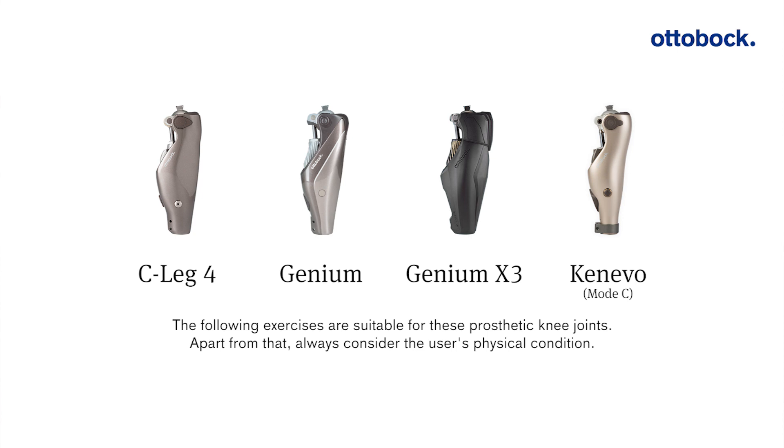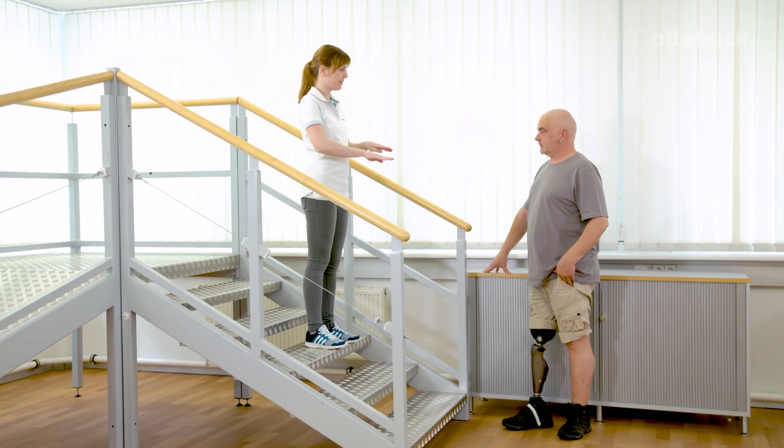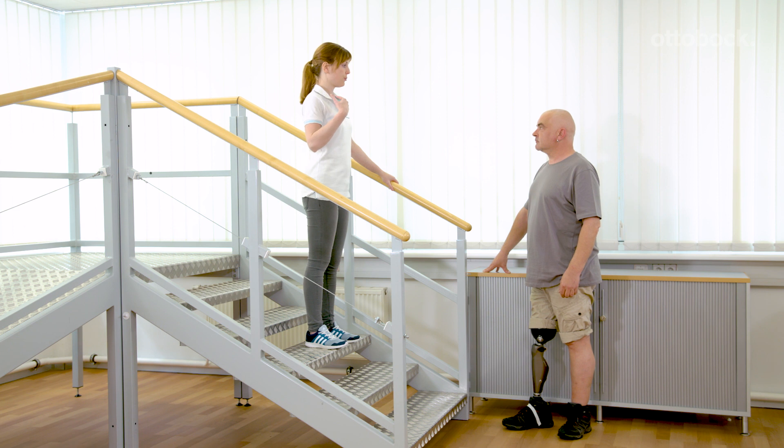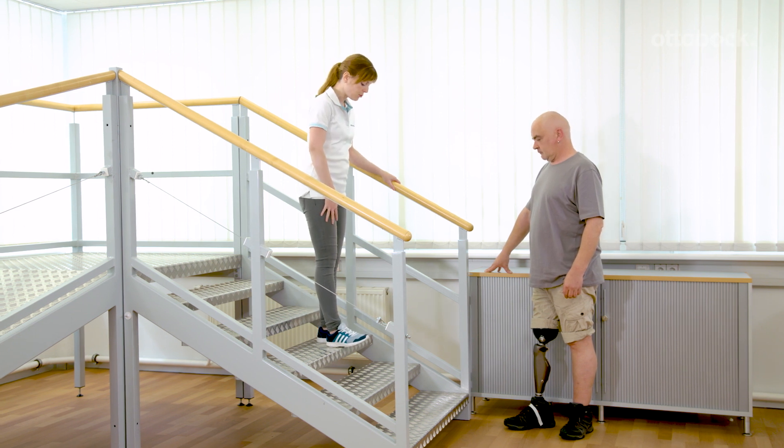The following exercises are suitable for these prosthetic knee joints. Apart from that, always consider the user's physical condition. The basic exercises for walking down stairs are repeated on the lower steps. Use the contralateral handrail in the beginning.